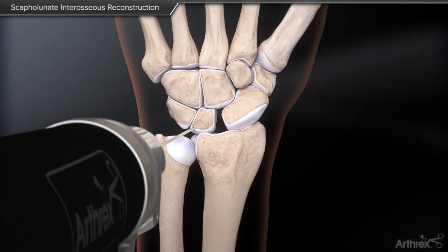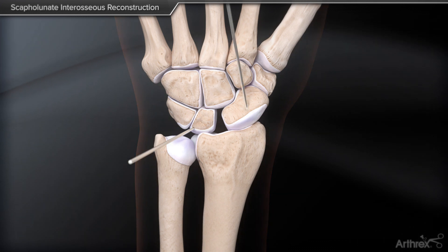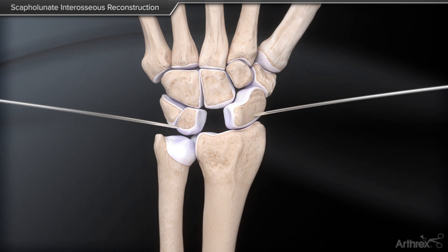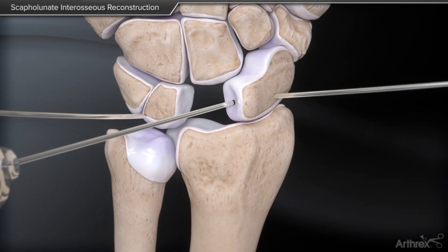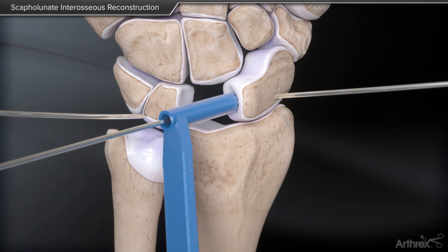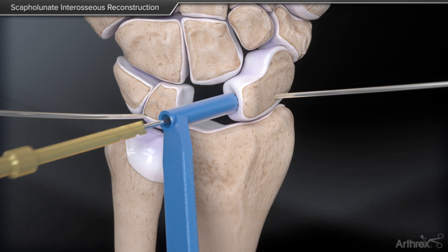Next, K-wires are placed into the lunate and scaphoid to position the bones for drilling. The laser-marked K-wires, cannulated drill bits and drill guides are then used to create the interosseous bone tunnels.